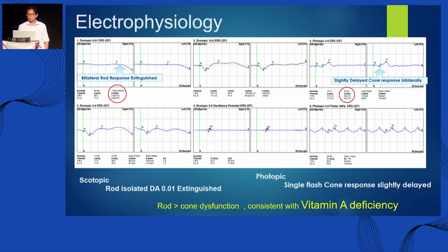You could also see in the photopic that there are slightly delayed cone responses. This is consistent with rod cone dysfunction, perhaps due to vitamin A deficiency, and we have treated this patient with vitamin A.